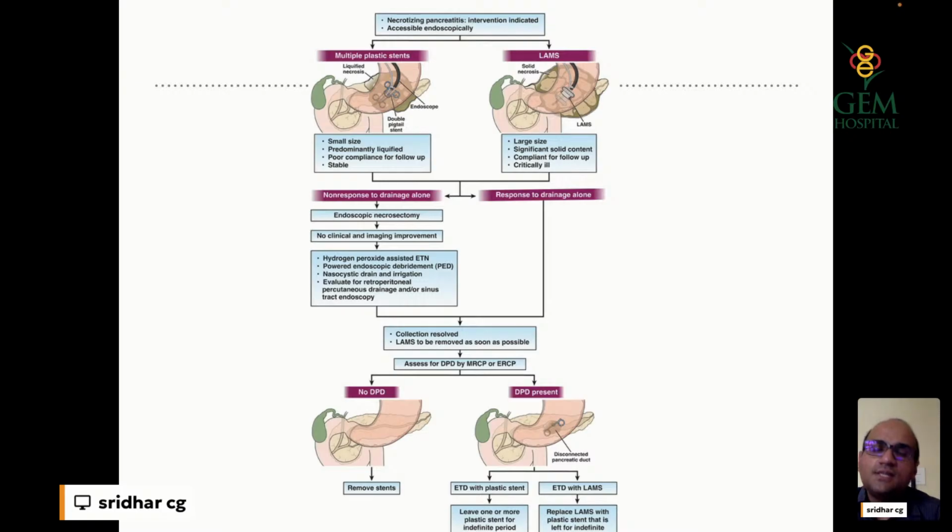Always have a multi-gate approach, with the percutaneous approach hybrid along with your endoscopic approach, by which better clearance can be achieved. Sometimes you can use a nasocystic drainage to facilitate flushing, and you can enter through the other gate to do the necrosectomy.